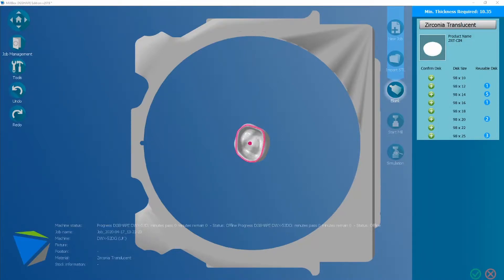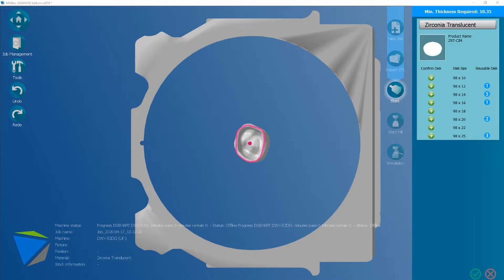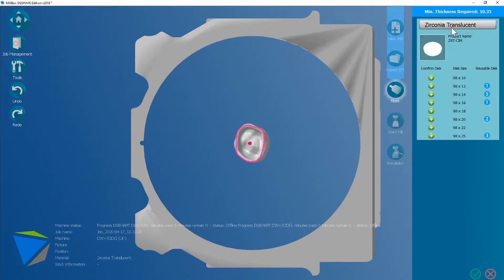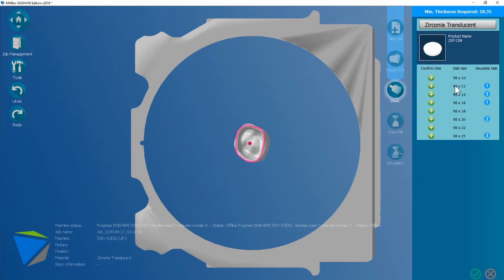Hi, my name is Joe, and I'm going to show you today how to add a new size disk into your pre-existing list in Milkbox. For today we're going to use the example of translucent zirconia, and we're going to add a 30 mil disk.